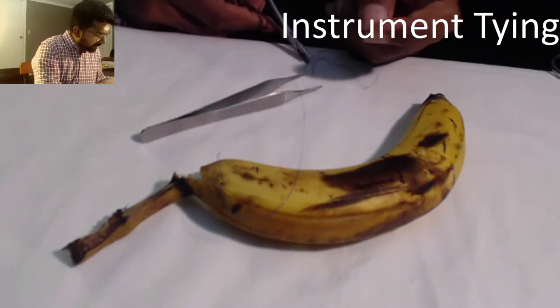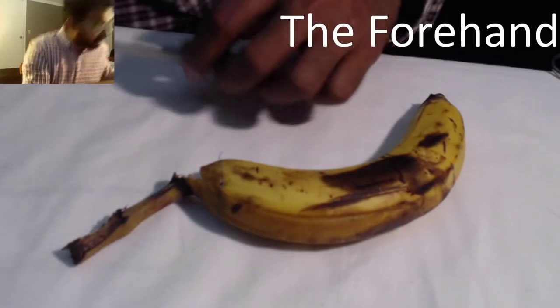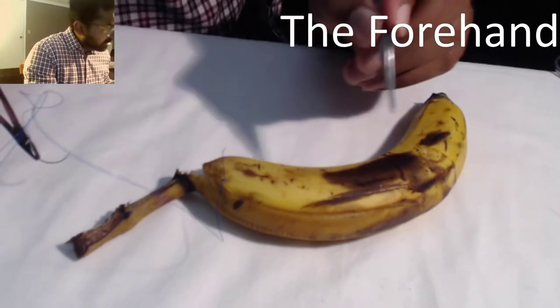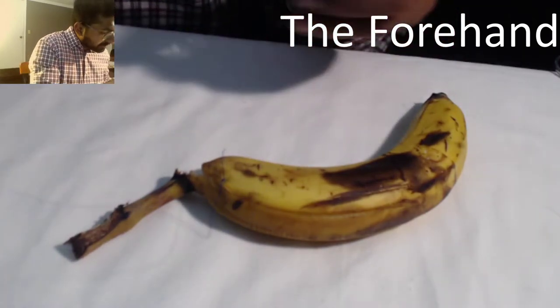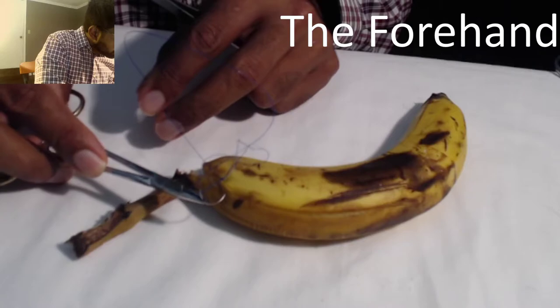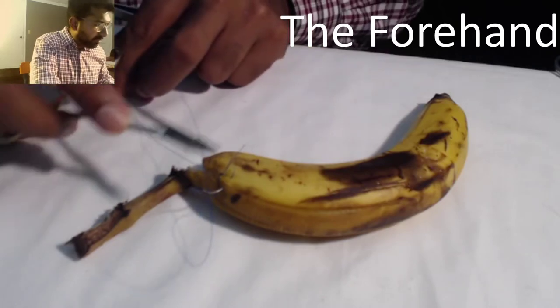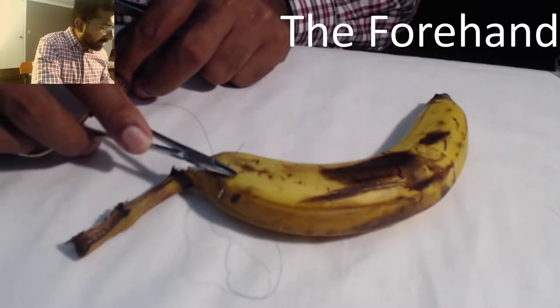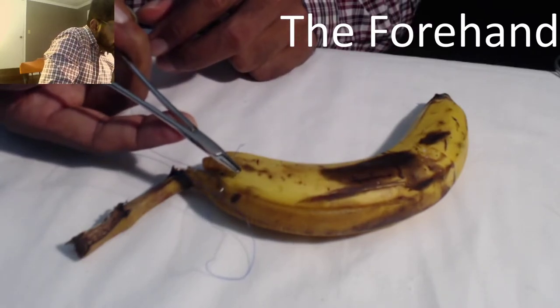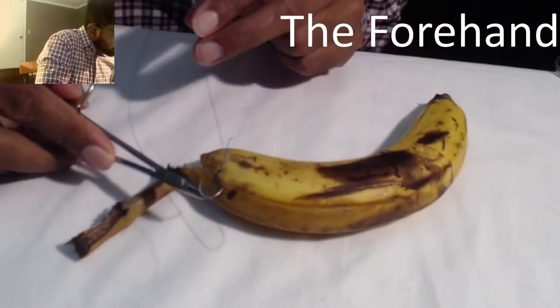With a single set of knots in place, we're going to go back to taking more bites. Notice the nice thing about the banana peel is that it's lined up for you nicely — you can actually see if you're traveling too much and get a sense of how that's going. We're going to take this bite: I'm going to pronate back, stick, turn. On this side I'm pronating my hand, getting it about 75% in, hyper-supinating so I can grab it, then supinate out — and that's our next bite.